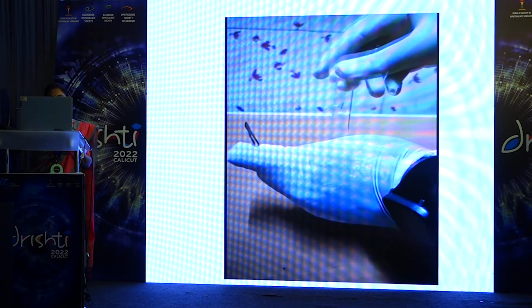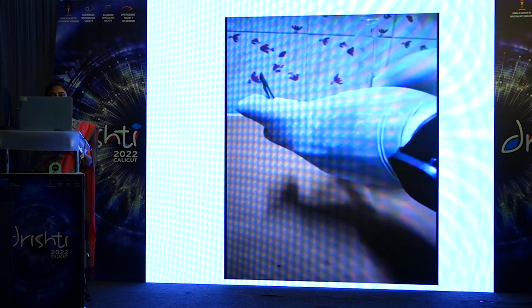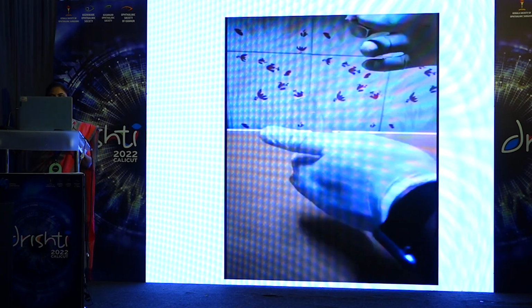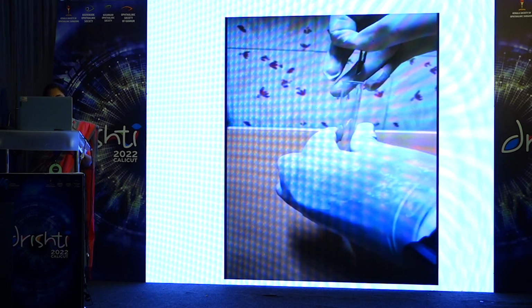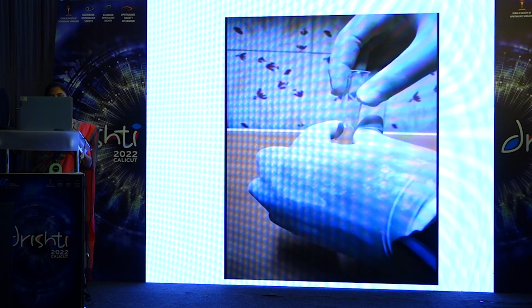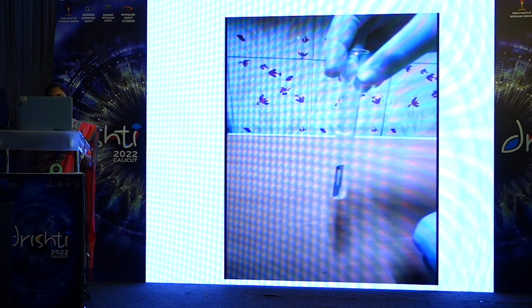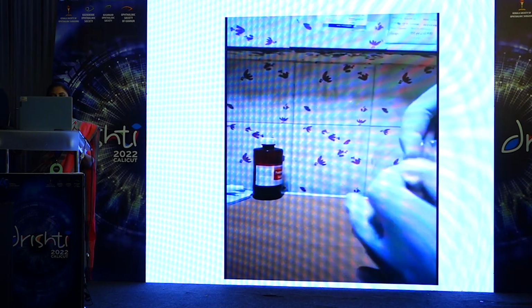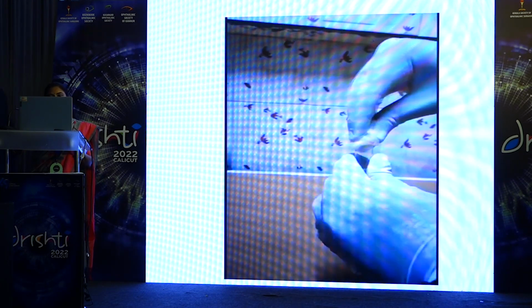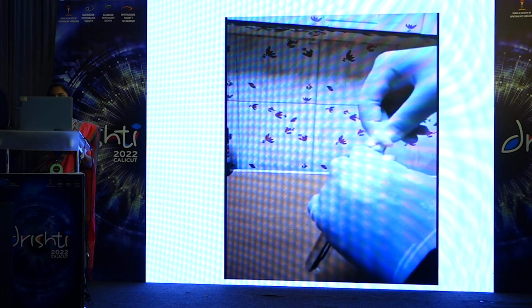This is the Sabouraud's dextrose agar, into which you can drop the scrapings. It is a fresh blade that we take for this, and the scrapings are directly dropped into the media and closed. We are using sterile gloves, so the chance of contamination is minimal. It is immediately closed and sent for examination. I think it is a very simple procedure which can be done with caution.